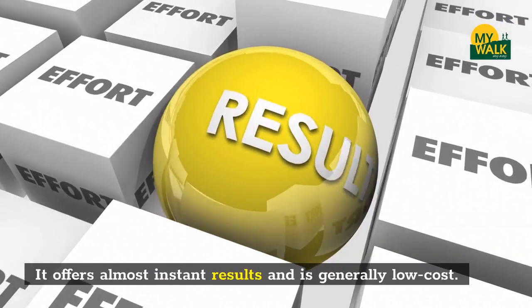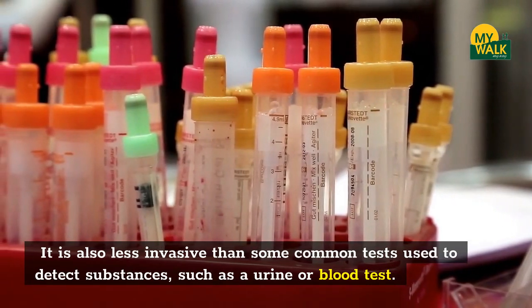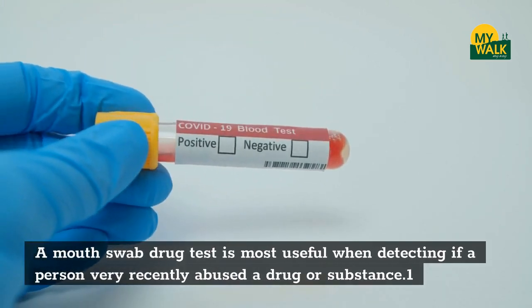It offers almost instant results and is generally low cost. It is also less invasive than some common tests used to detect substances, such as a urine or blood test. A mouth swab drug test is most useful when detecting if a person very recently abused a drug or substance.